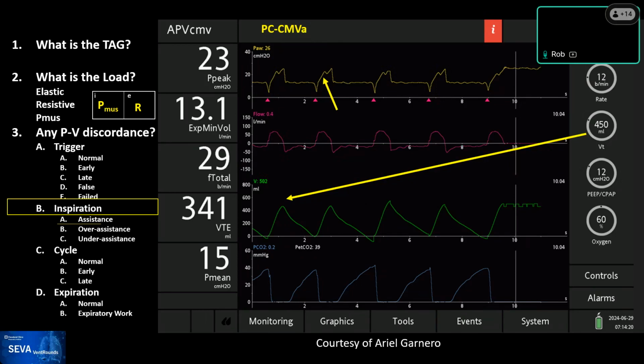There's a lot going on here, right? So when you think about plateau pressure and the effect of auto peep, you've got to figure out how it affects the plateau pressure. Auto peep in and of itself depends on the mode. In volume control, auto peep will increase the plateau pressure for a passive patient.